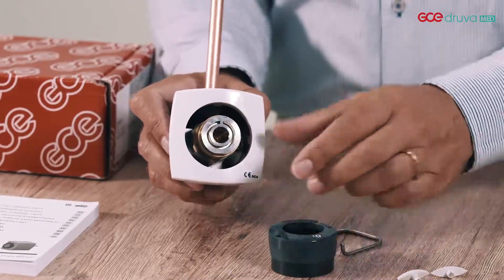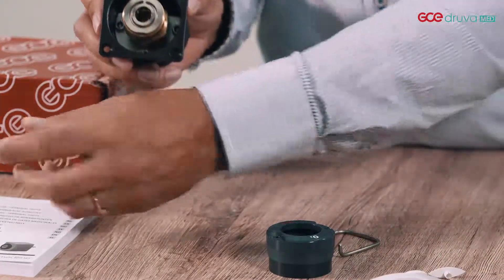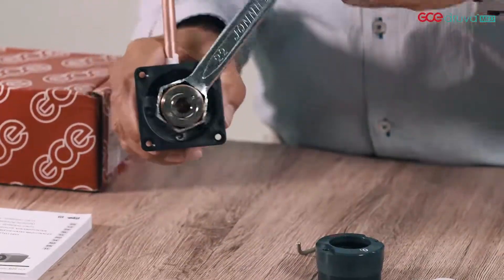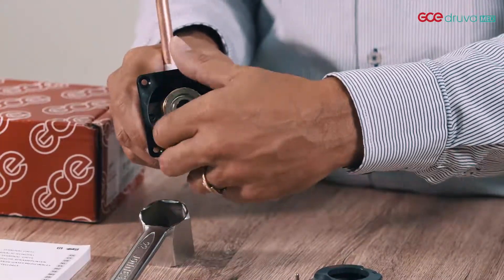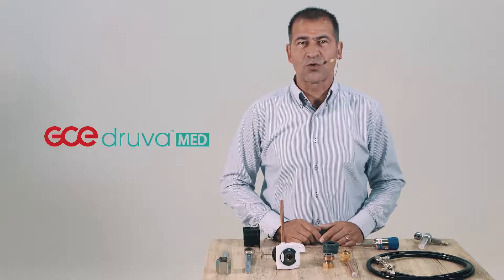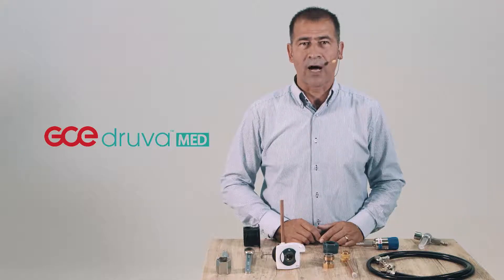Now the button is removed. Your cover plate can be removed, and with the special tools you can easily disassemble the unit again. GCE MediUnit is built to last and provides more safety, reliability and ease for patients, medical staff and technical staff. We do care about you.